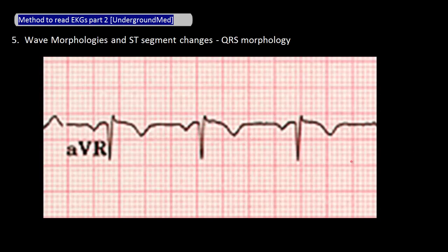Let's look at this EKG for Q waves. Look at this — a nice Q wave in AVR. What do you think about this Q wave? Remember, AVR is a special lead and in general not very useful. Its direction is opposite all the other leads, so what looks like a Q wave here is actually just a flipped R wave.